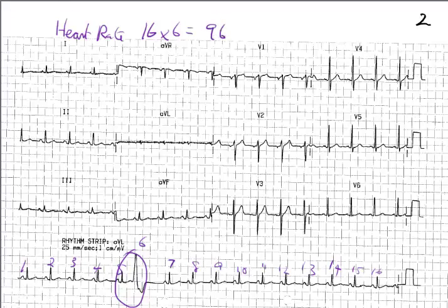The next thing to do is to determine the rhythm, and that's what this ECG is about. There's obviously a beat that's strange — this one here, which we've already highlighted. It is out of place. Because it's early, it's called an ectopic. So that beat there is an ectopic.